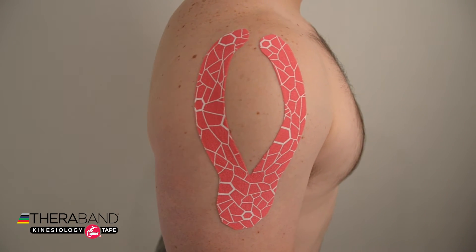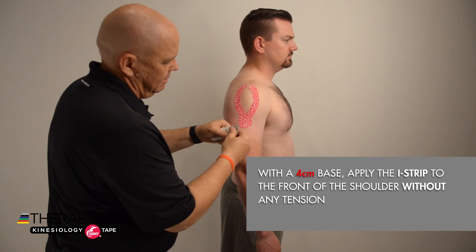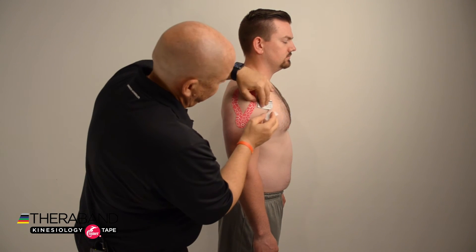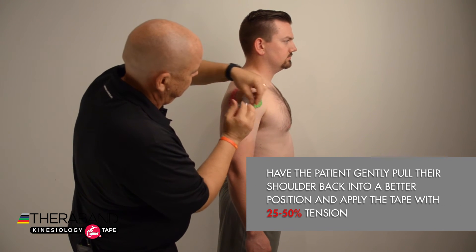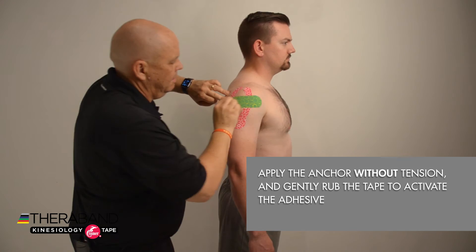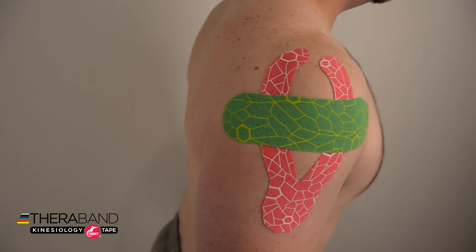For the I strip, we'll break the paper backing at about four centimeters on one end, remove that paper backing, and apply our anchor in the front of the shoulder without any tension. Then remove the paper backing and have the patient gently pull their shoulder back to a better position, and apply that tape with 25 to 50 percent tension. Remove the paper backing for the other anchor and apply without tension, and gently rub to activate the adhesive.